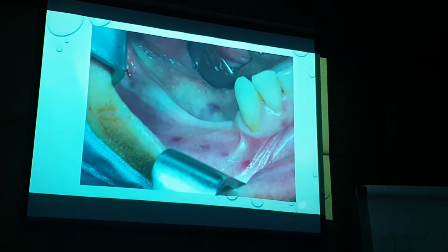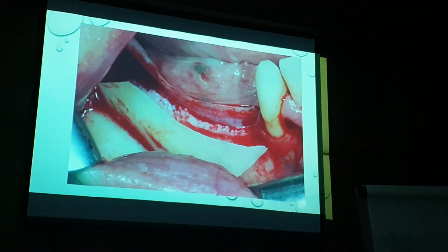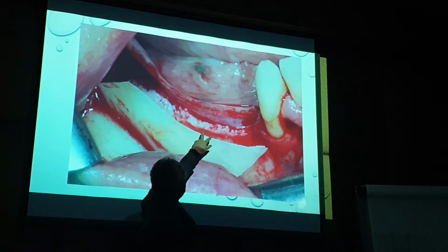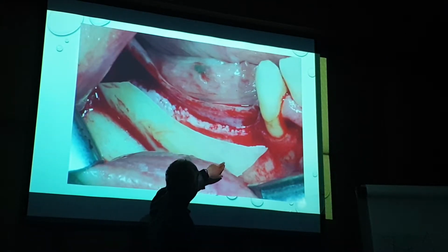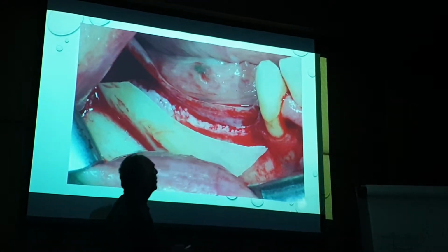With a Khoury bone plate, you can take a piece of bone and, just like doing a ridge split, except now you're intentionally separating your plate from the rest of the bone. And what I do here is I will actually put a spacer. I have little spacers that I use, and I use the spacer to keep the block out while I put the bone screws in. If I remove them, then I'll put my bone graft inside there.